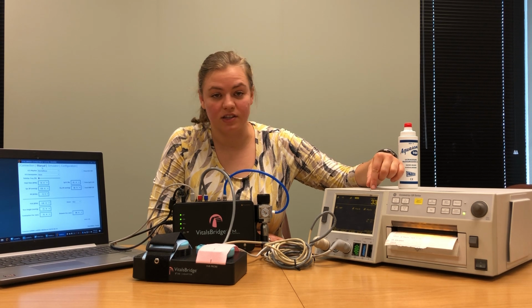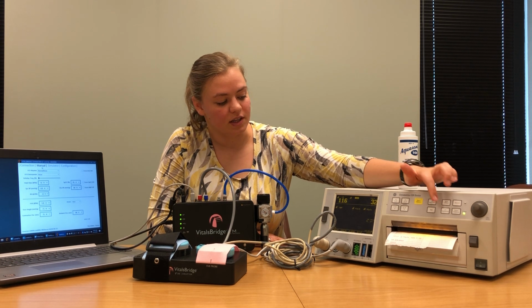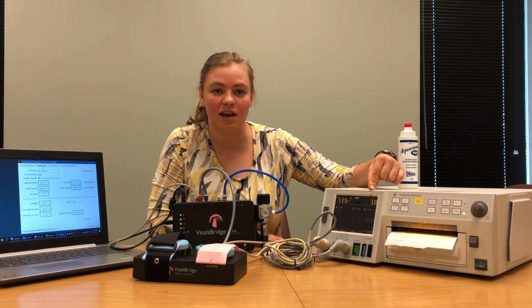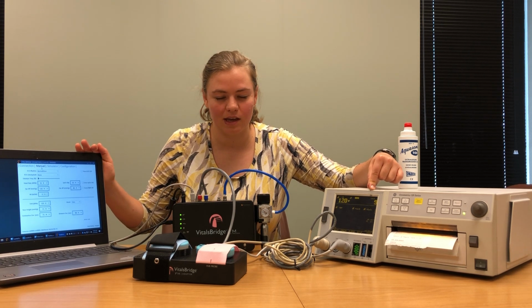The last trough I saw was close to 30, so when it reaches down to 30, that's when I'm going to reset that UA reference. It's just about there in the trough. So I'll select the reference button, which will drop the TOCO value down to that 10 that we want it to be at, and then the next contraction should be calibrated with what our connector software has.